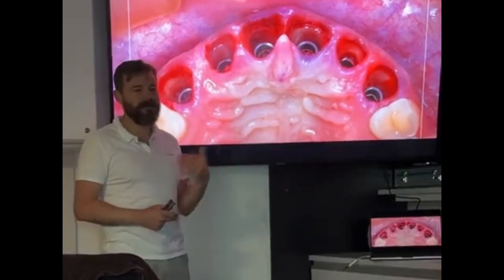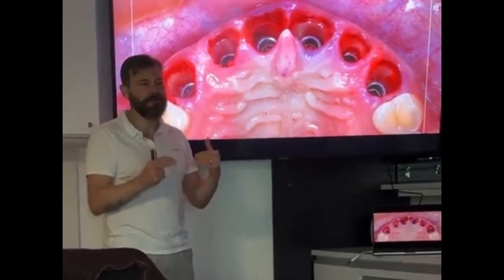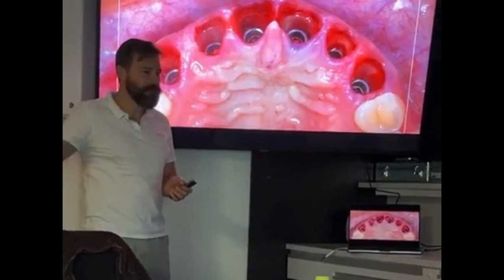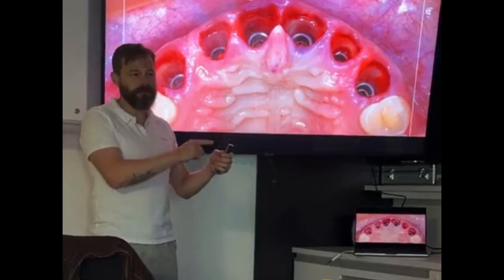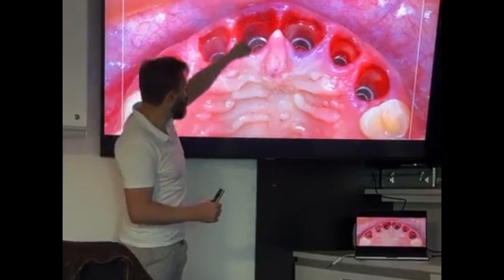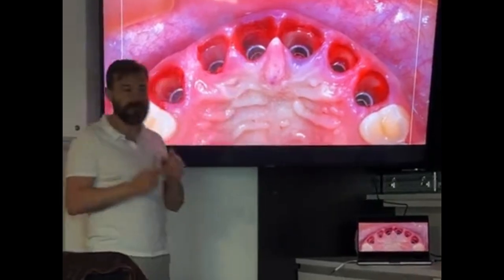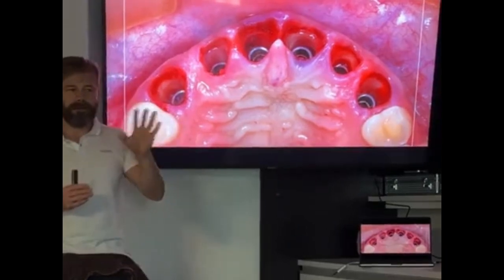Sausage technique, according to the membrane that you are using, in a few weeks the membrane is not there anymore. But at least it gives mechanical stability in the beginning. It does not matter the technique that you are using. If you do not fix that well, and if that moves, it's not going to work. Here, basically, is the same. The biomaterial itself, being held in this small space, is going to be completely fine and is going to integrate. But if by chance the socket is a little bit larger and you put the biomaterial there, there is movement, that is not going to work.